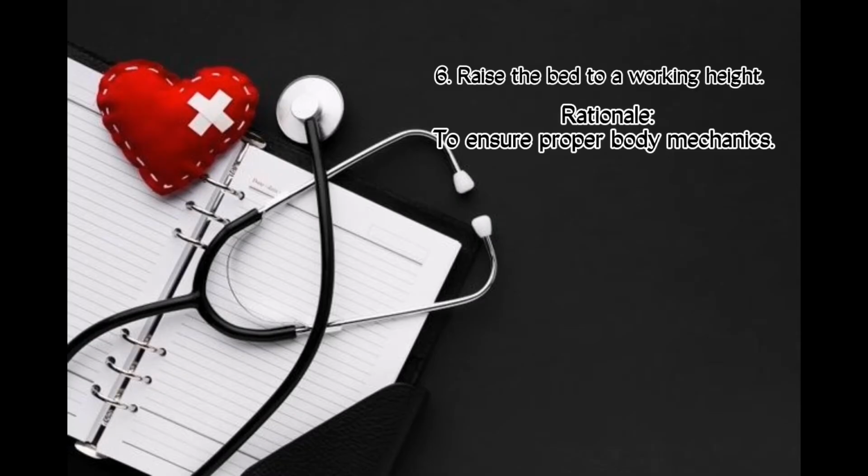The next procedure is to raise the bed to a working height to ensure proper body mechanics.